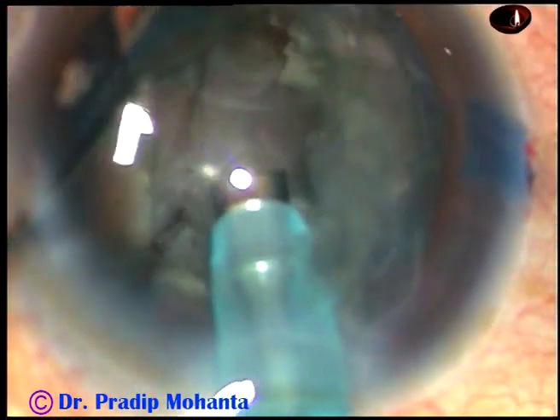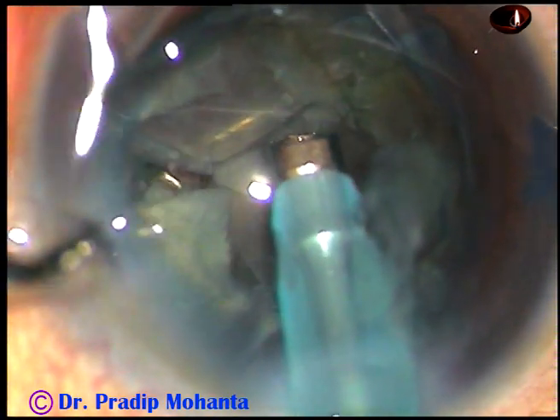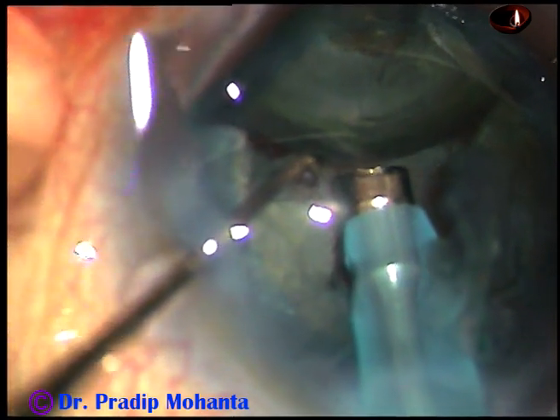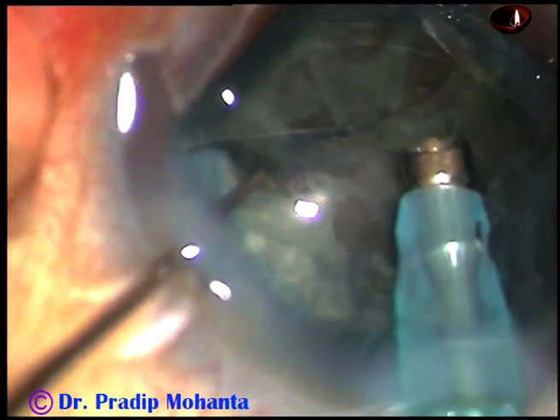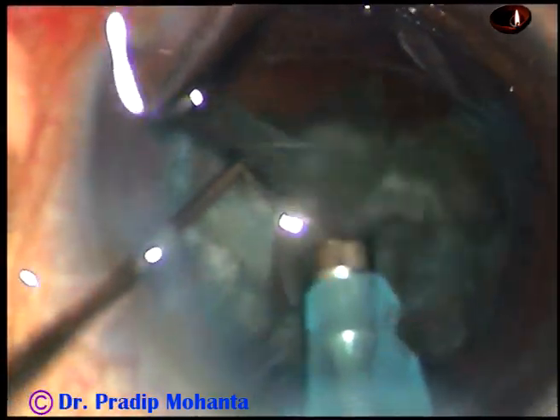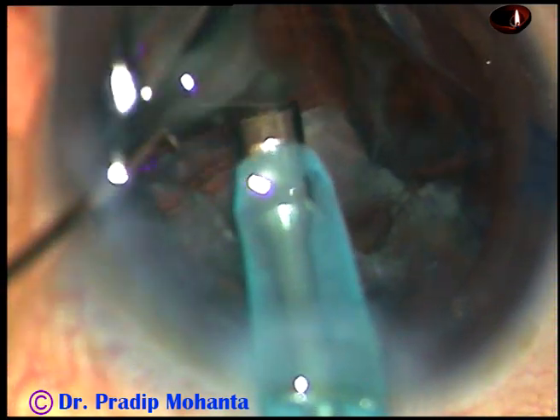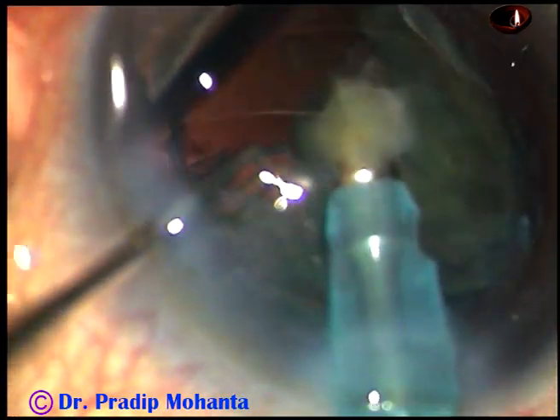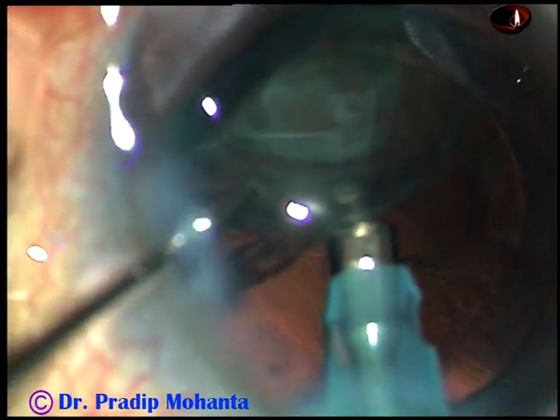Now I find one more fragment. This is the smaller part of the nucleus — I just tilted it. Now I am going to phaco mode 2, asking the assistant to switch to phaco mode 2. At this time vacuum is high — 350 mmHg, flow rate is 35, and power is the same at 50%. Always try to tilt the pieces so the inner edge is elevated, then attack the piece. Tilt it, go at the edge, and apply energy.